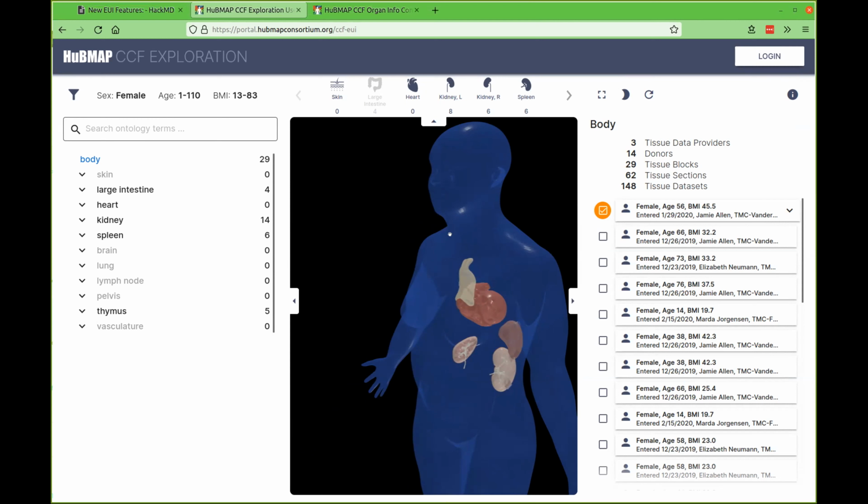Yeah, so that was why I was going to ask whether you can have a more detailed level where you have anatomical landmarks that you can use to match with the histology sample. Yep, that's something we've been working on, but not quite ready yet. But that is in the works right now. Yeah, okay, because that's also important to know whether we have enough coverage of a certain area of the kidney but not of another one, and I'm still not sure whether they are all from the same place or not. Yeah, thank you.